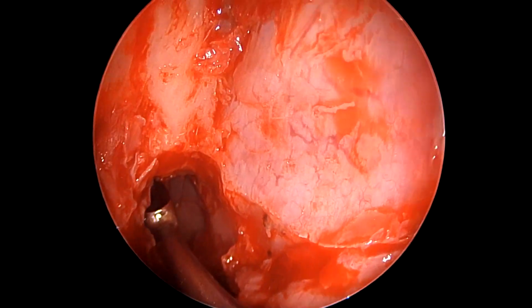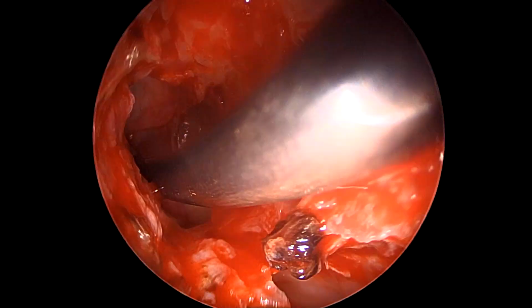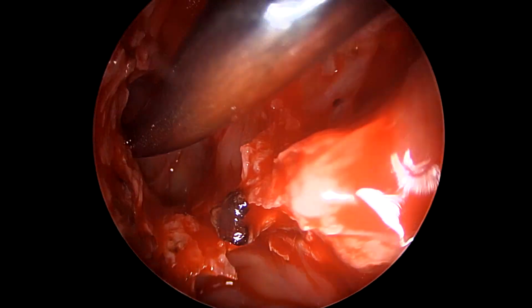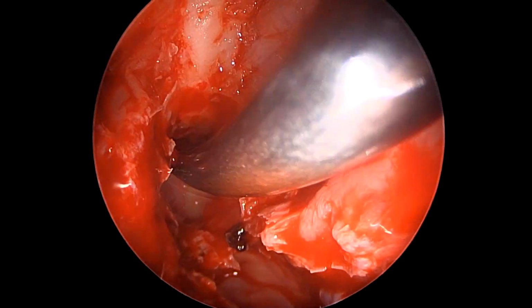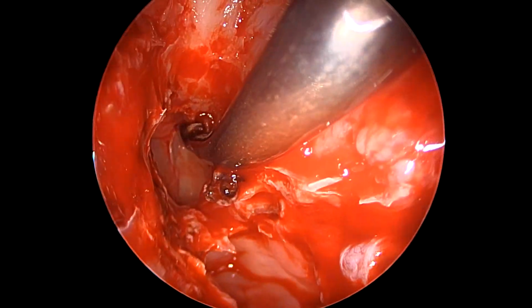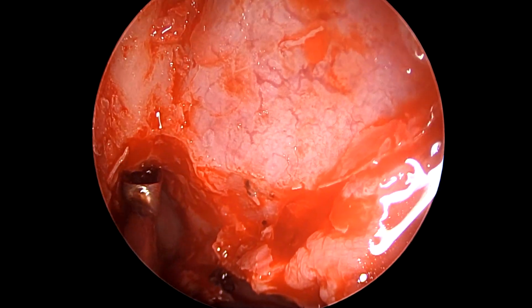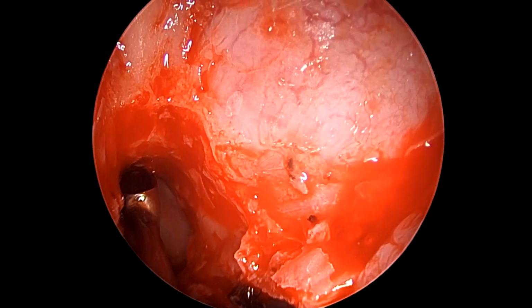As we see here, we're still using the curette to more generously open the recess, because whatever we open now will obviously become slightly scarred in the post-operative period. And for us to be comfortably giving this patient an open frontal sinus, one has to create a reasonably large opening which could be sustained eventually after surgery as well.